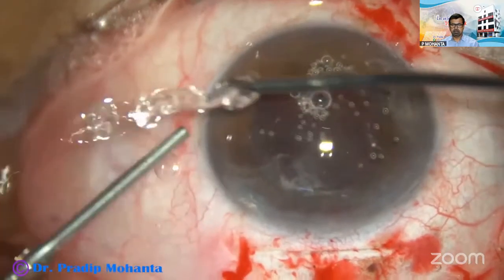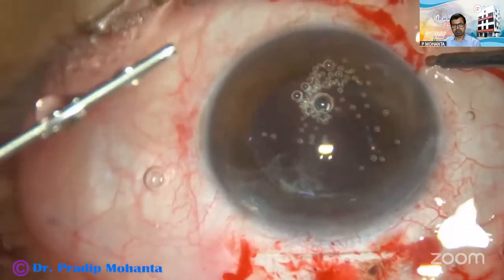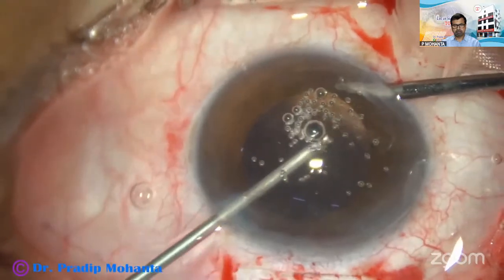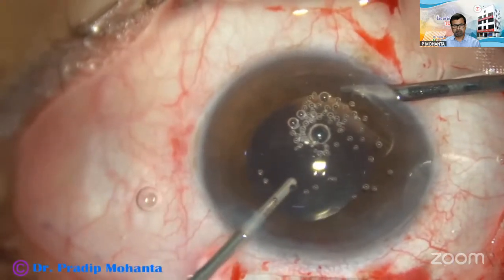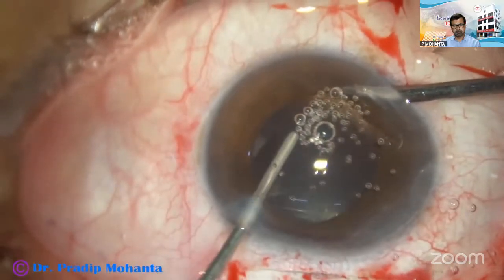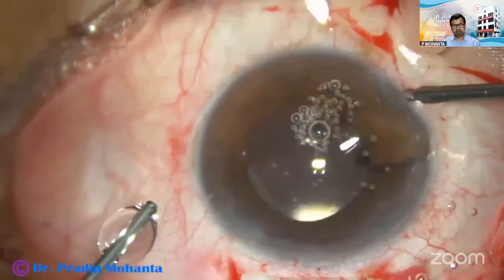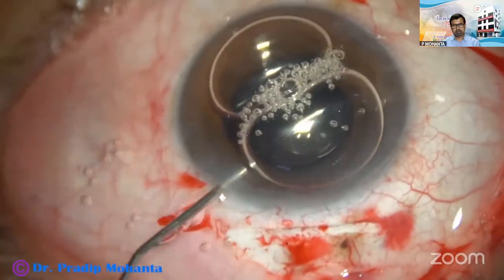So I take the vitrectomy cutter and shave the vitreous strands. We can even go behind the lens and do some cleaning of viscoelastic substance that goes behind the lens. A nice anterior vitrectomy is done, and when you do a nice anterior vitrectomy, you get a very good result.